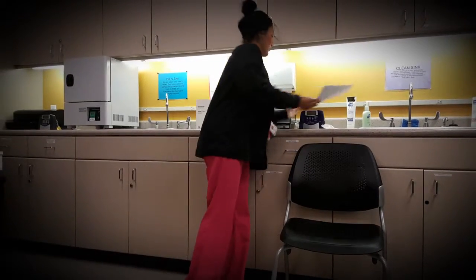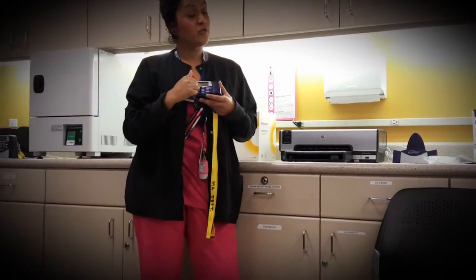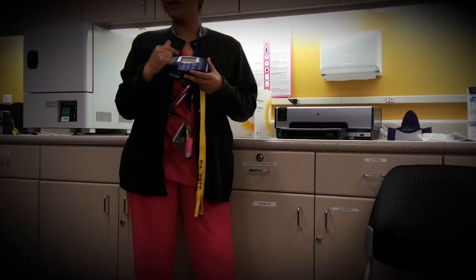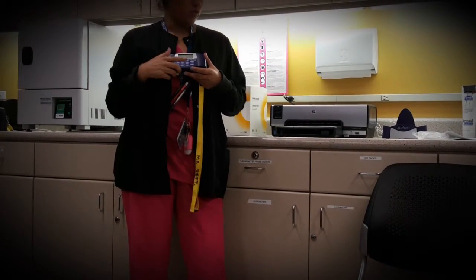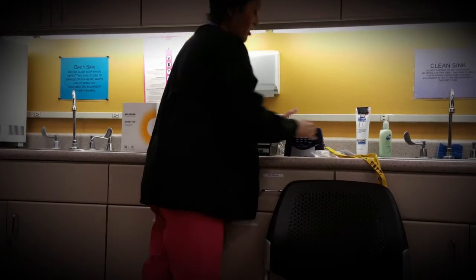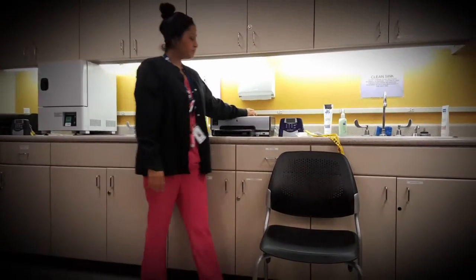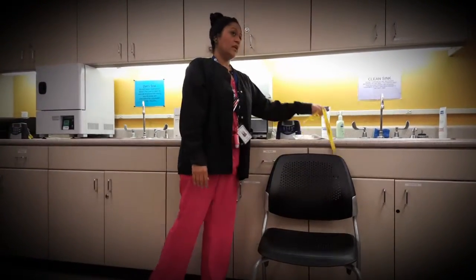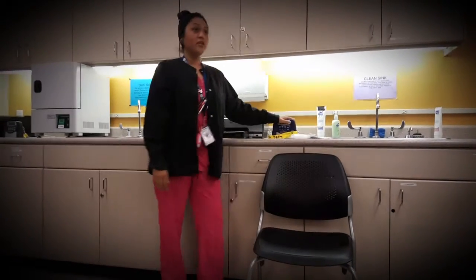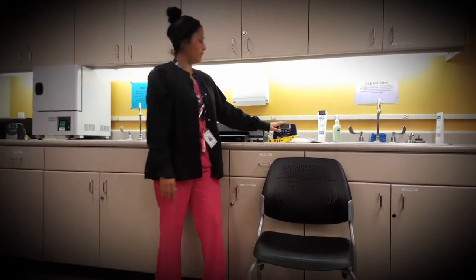The machine works kind of like an old phone — you have to keep pushing a number to get to the letter — because you have to enter the patient's demographics. The machine will prompt you on what you need to do. It has to stay on the dock in order to charge and to print. You can remove it to input information, but when you're done with the patient and going to print, it has to be back on the dock.